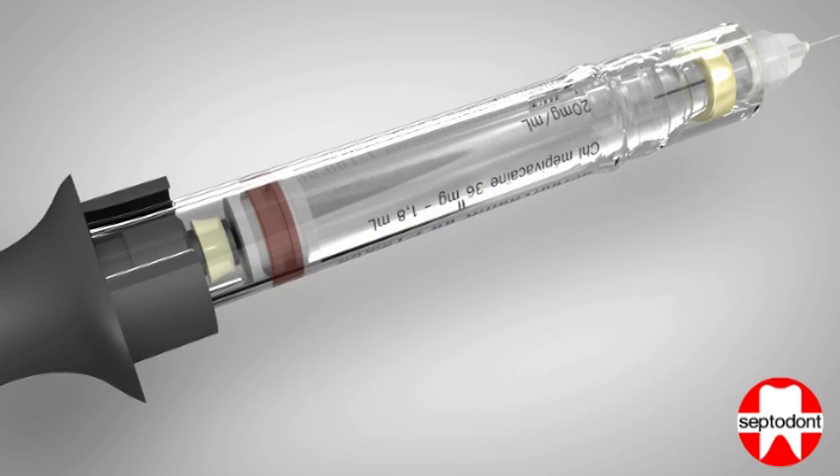The second form of aspiration can be obtained by the pliable O-ring that is situated at the end of the handle plunger. This O-ring creates a vacuum directly behind the cartridge piston when the plunger is slowly withdrawn.